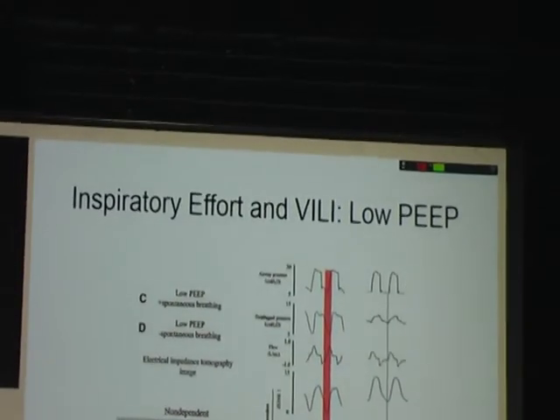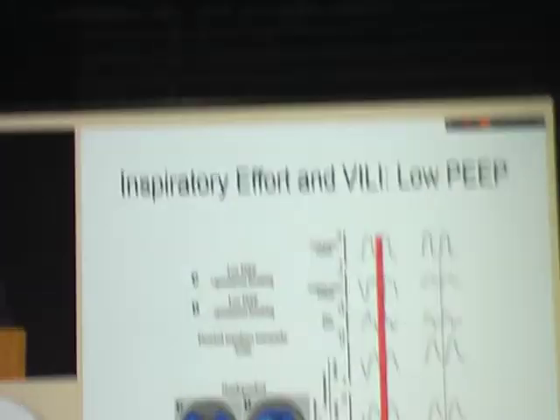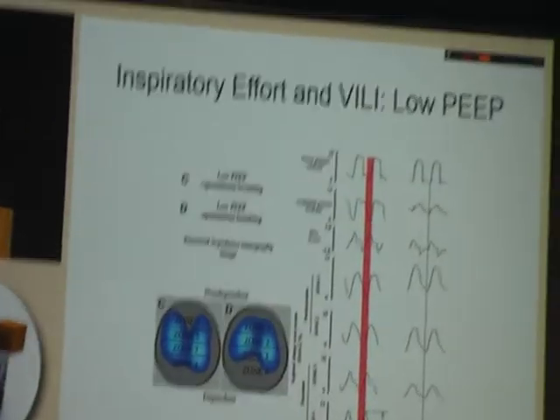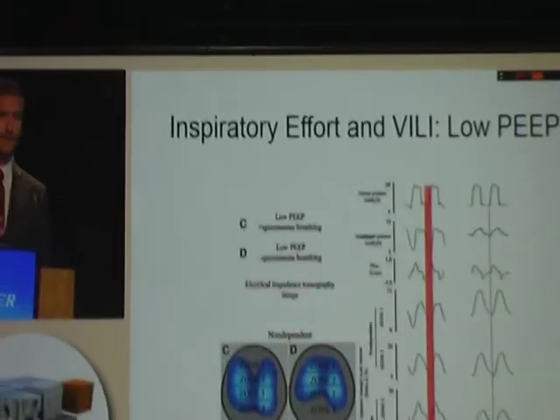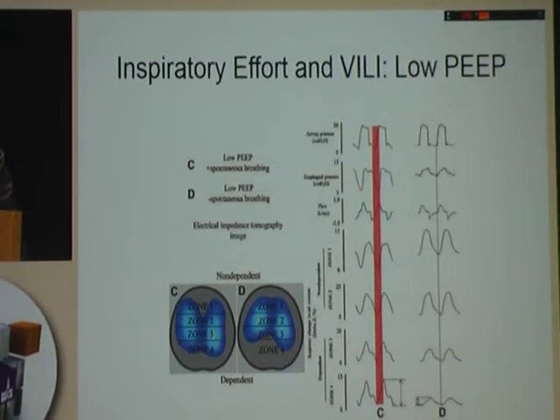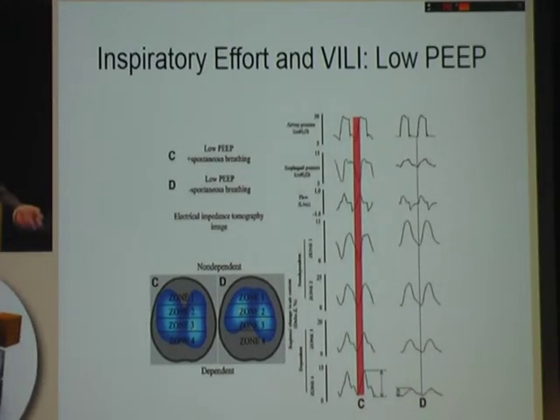And this was demonstrated convincingly again by Tedeschi in an earlier paper and again in this paper, where they used electrical impedance tomography to image where ventilation is going during the early phase of inspiration. So if you look at the first column of EIT tracings here on the left, these images were collected during spontaneous breathing and then subsequent paralysis, both at low PEEP.